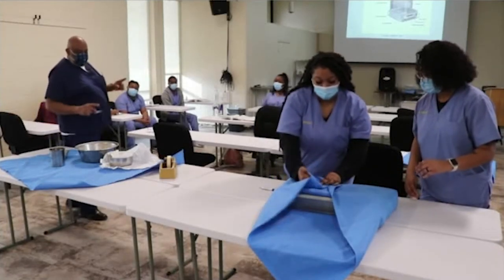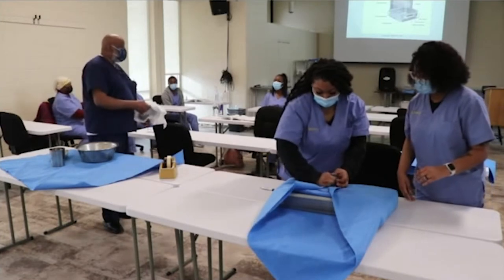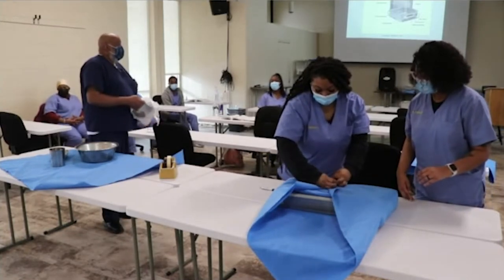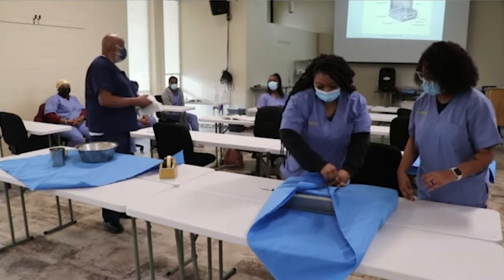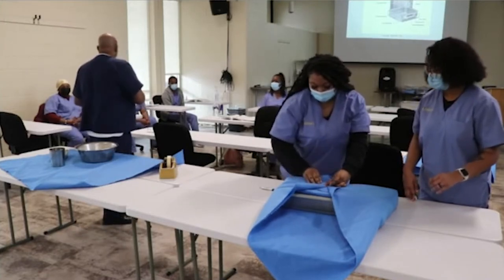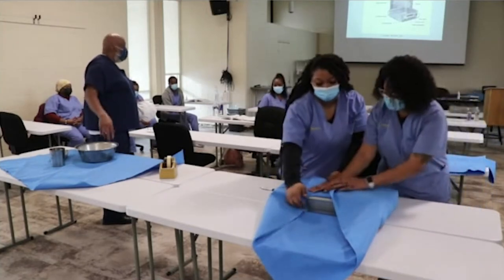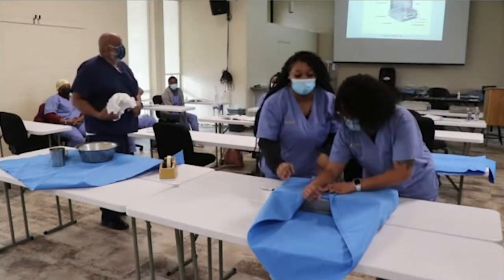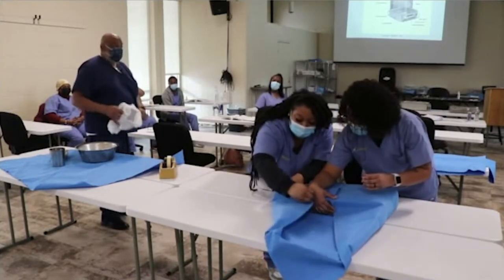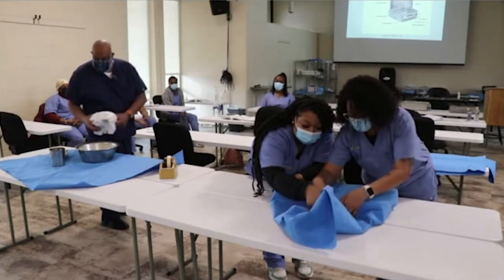One of the tricks that you're going to learn, and I'll teach you here. Here we go, this technician did it. They put one of the indicators on the liner so that they could see it when they first opened it up. And then you always want to put one on the bottom because you don't know how much time they have. If it's an emergency case, they have to open up and set up. It's not like it's the first case where they have time to set up.